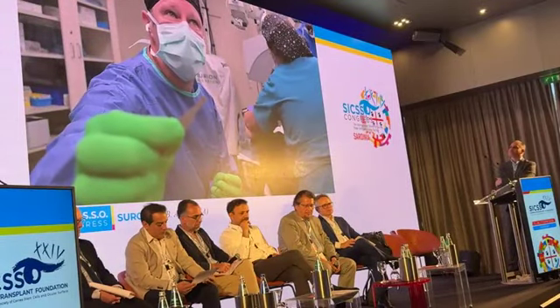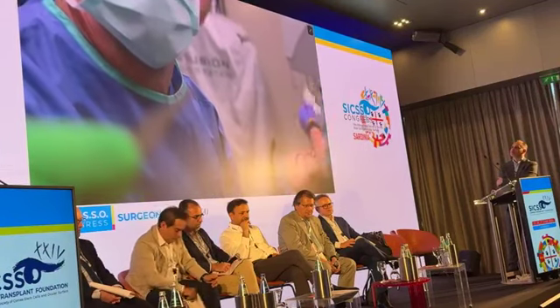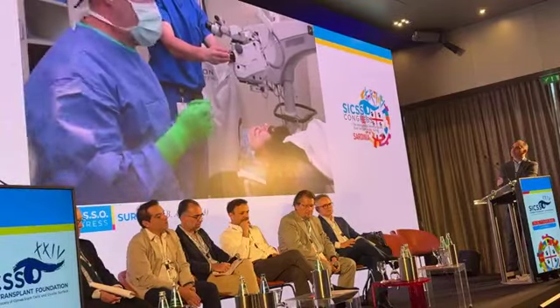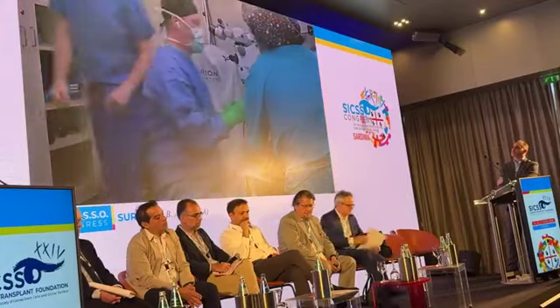Let's see if we can do the microscope speed too. That's good. But then just hit the focus button so you can get it. But they have these, that's okay, I'm too close. Let's switch to the scope feed, guys.